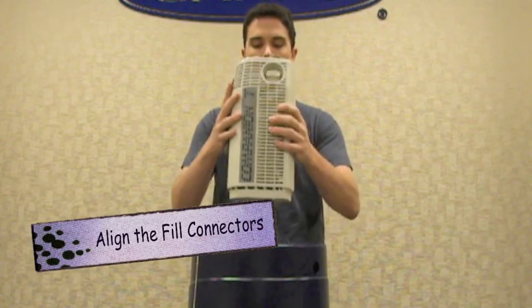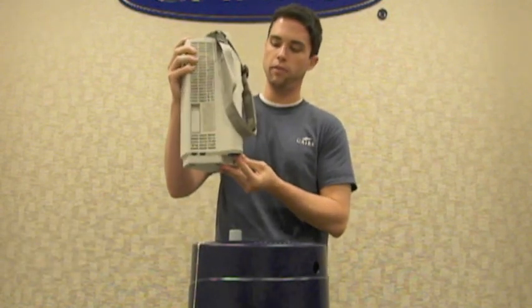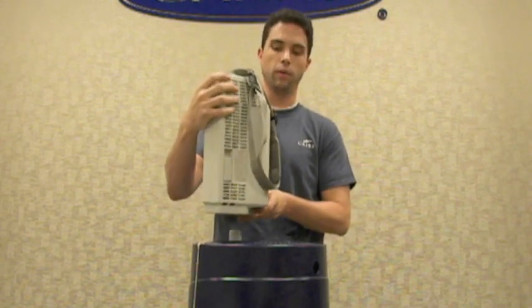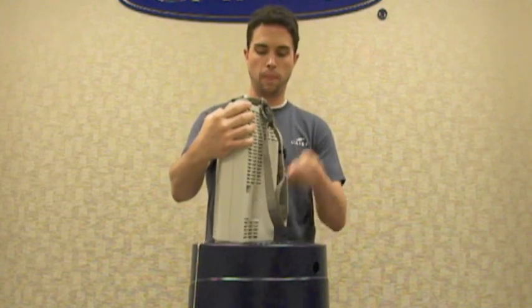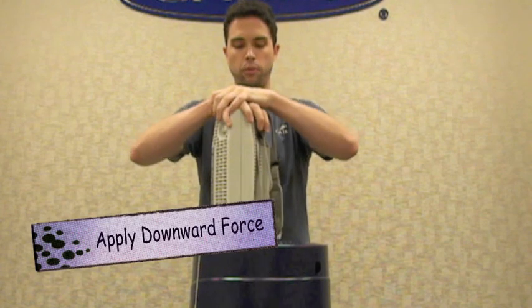To fill the companion unit, the first thing you want to do is align the fill connector, which is here on the bottom of the unit on the back side. You want to align it with the blue fill connector on top of the reservoir. Align your fill connector and apply downward force down with both hands.